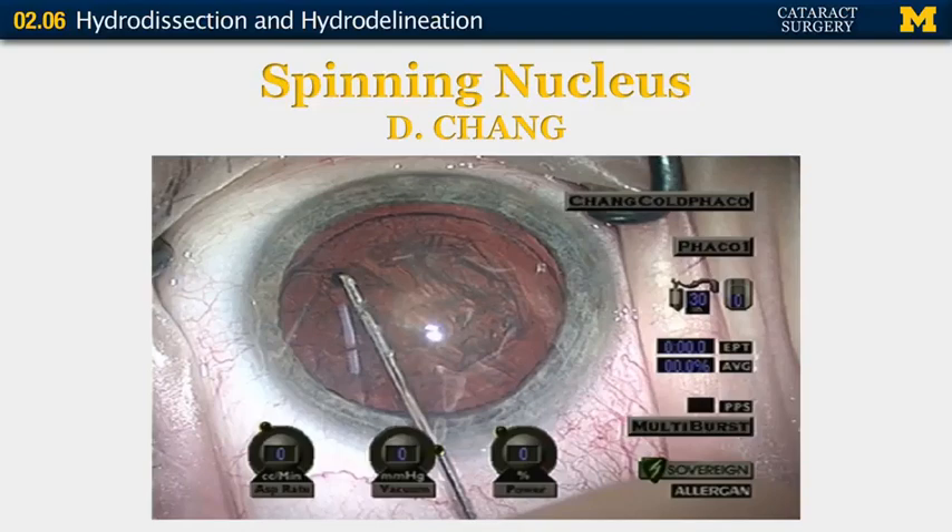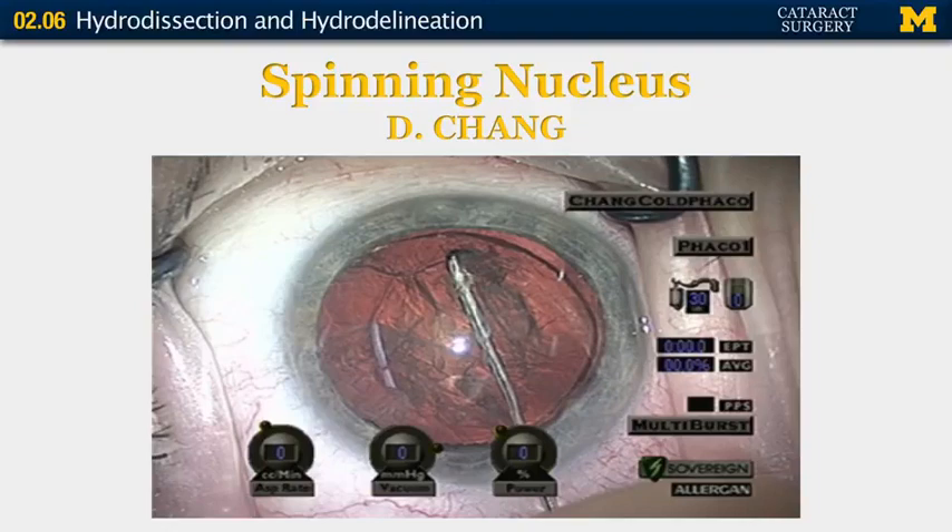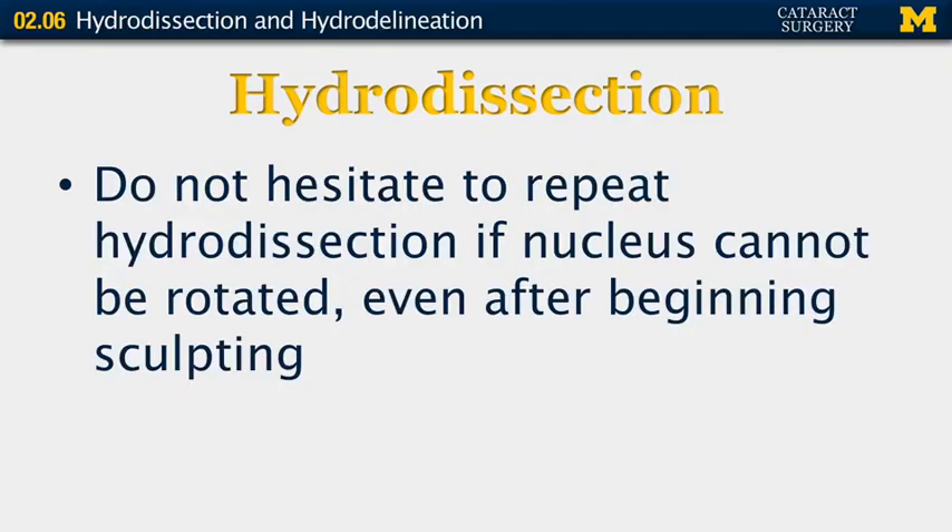The nucleus is engaged with the cannula and moved clockwise to spin the nucleus. Hydrodissection can be repeated at any stage of the nuclear sculpting, so don't hesitate to rehydrodissect if you find that the lens can't be rotated well or, after beginning sculpting, the nucleus is not mobile enough.